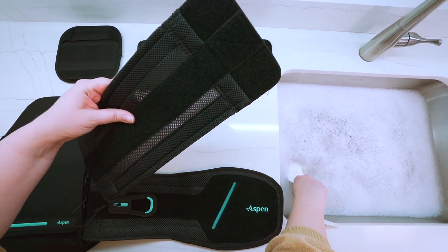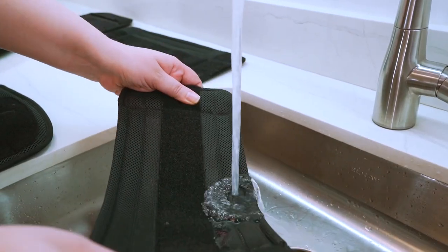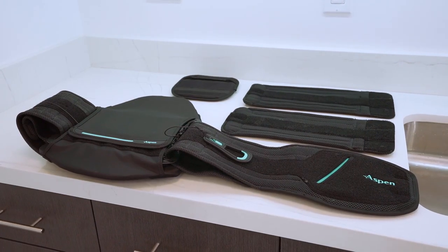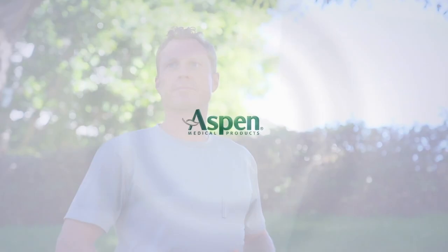To clean Horizon Pro lower spine products, hand wash with mild soap and water. Rinse thoroughly and allow to fully air dry. For more information regarding the Horizon Pro line, please visit aspenmp.com.